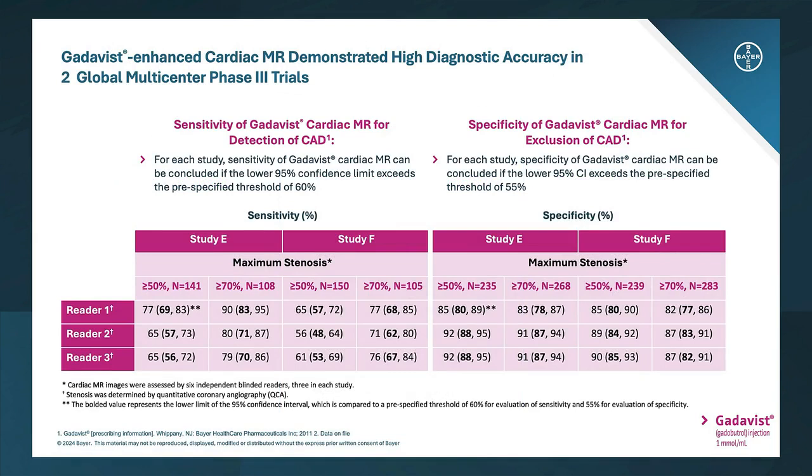This slide shows the high diagnostic efficacy that was demonstrated with Gadavist-enhanced cardiac MRI across the two pivotal trials. For each study, images were read by 3 independent readers.